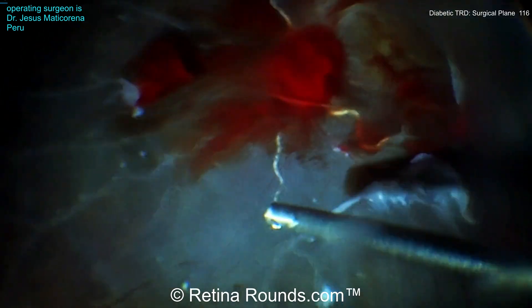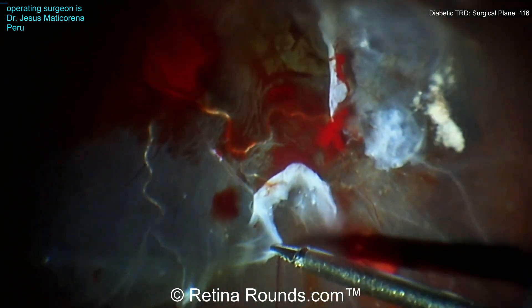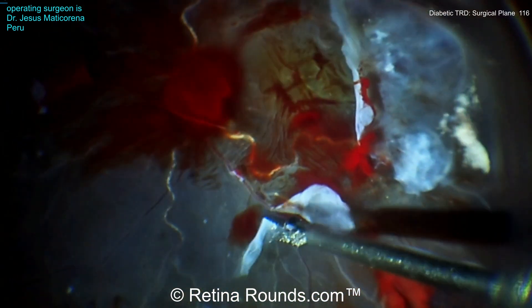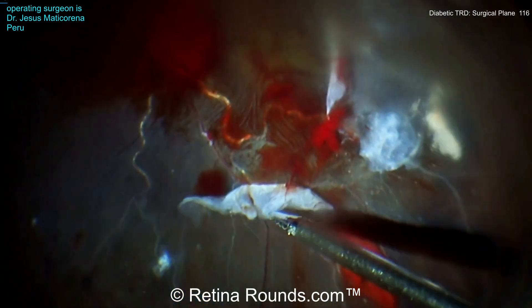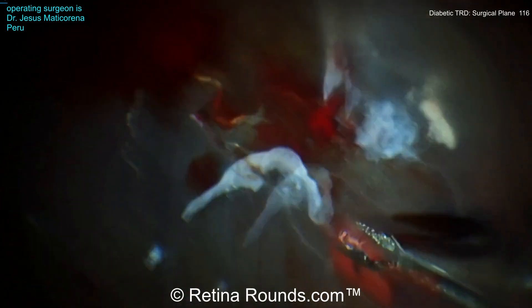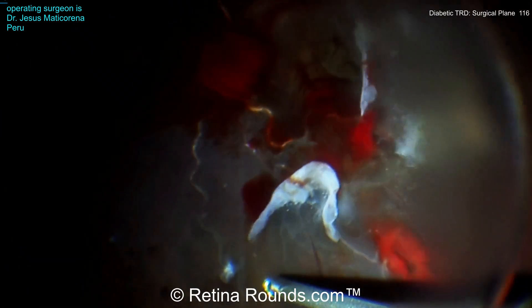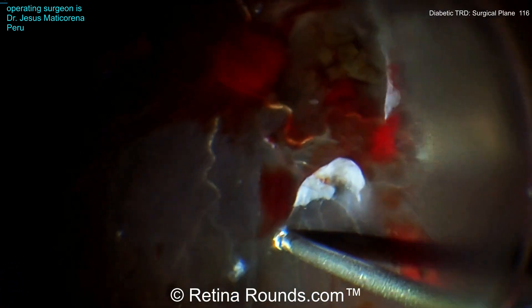Going back to the forceps, elevating and trying to pull up on this membrane on the posterior side where the vitreous has already been segmented. Not able to do that, but then going back to the cutter and elevating up the vitreous anterior to this area of fibrosis — going around 360 degrees is going to allow him to safely delaminate that area.